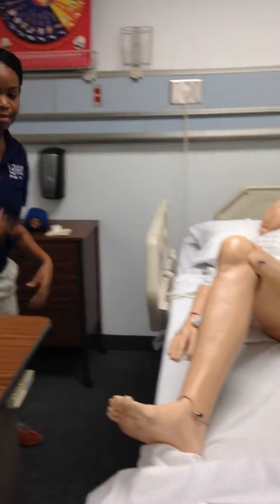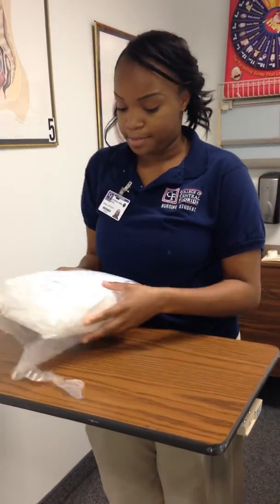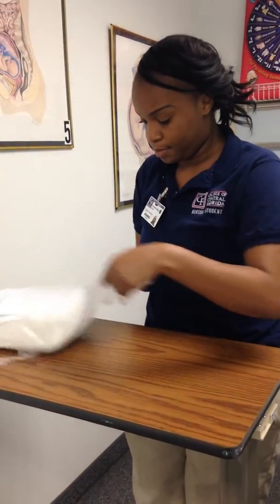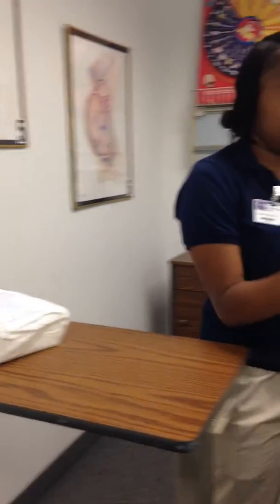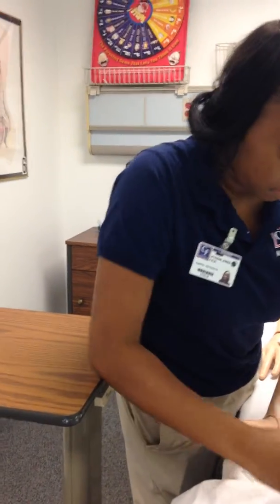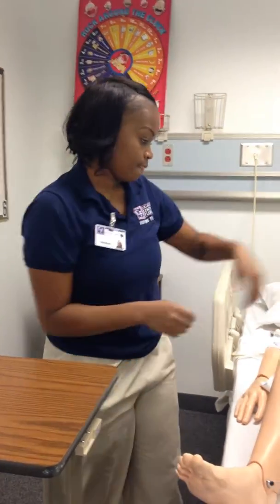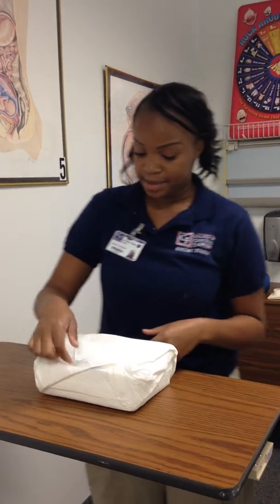Just put the tape back. So I'm going to go ahead and open up my kit. I'll wash my hands again, open up my kit. I'm going to use this as a little bedside trash can. Go ahead and pull the gown down just to provide a little privacy while I'm getting everything ready. I can open up my kit.